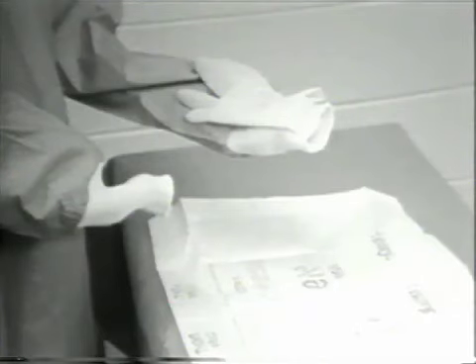What gloving technique does this scrubbed person plan to use? This person is working without assistance, using the closed gloving technique. Which glove is put on first? The glove for the non-dominant hand is always put on first.